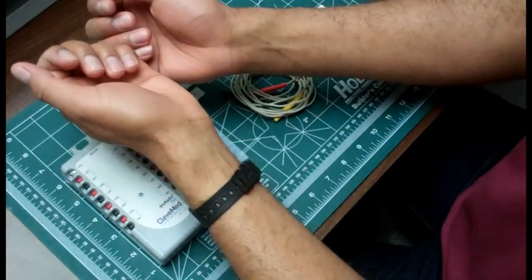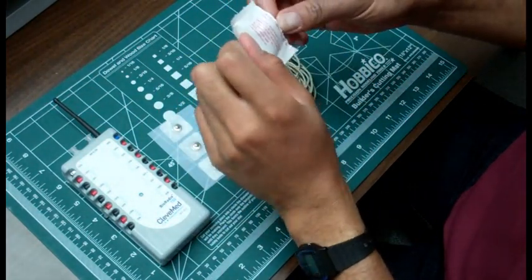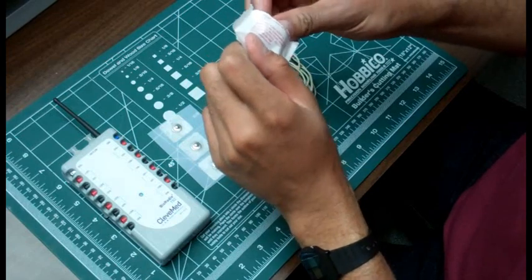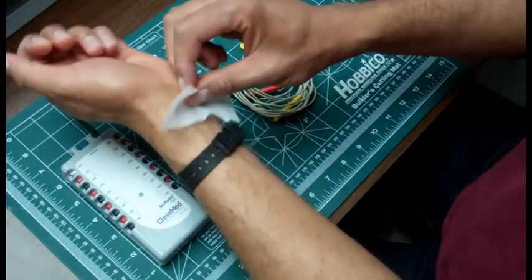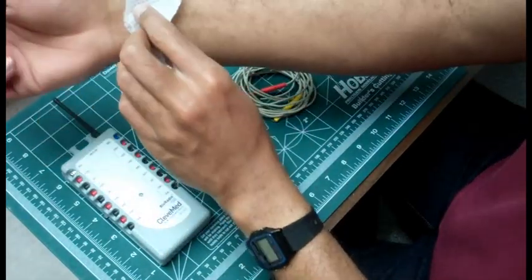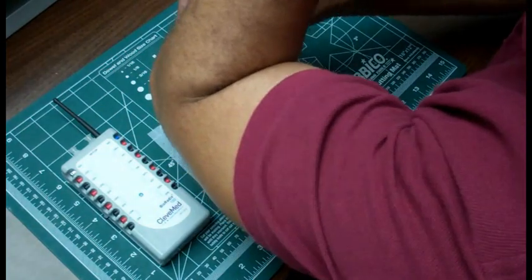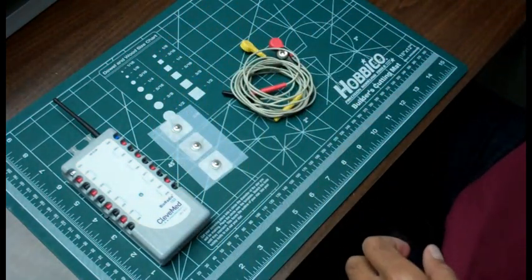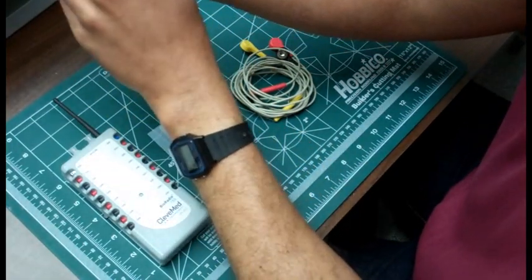We will record ECG from the wrist. We will clean the skin with an alcohol wipe. You can use a paper towel or napkin to wipe off excess alcohol.